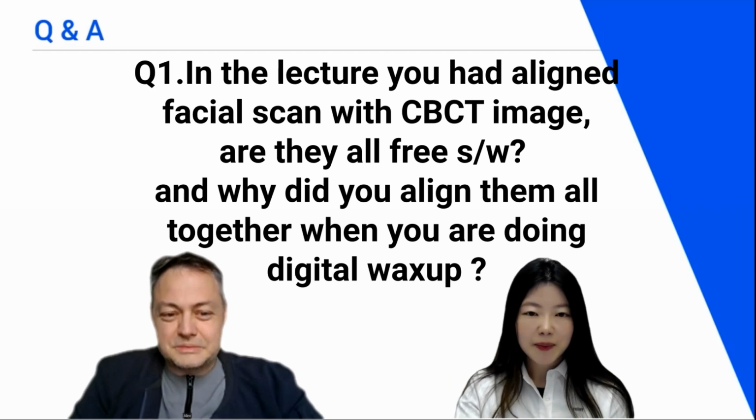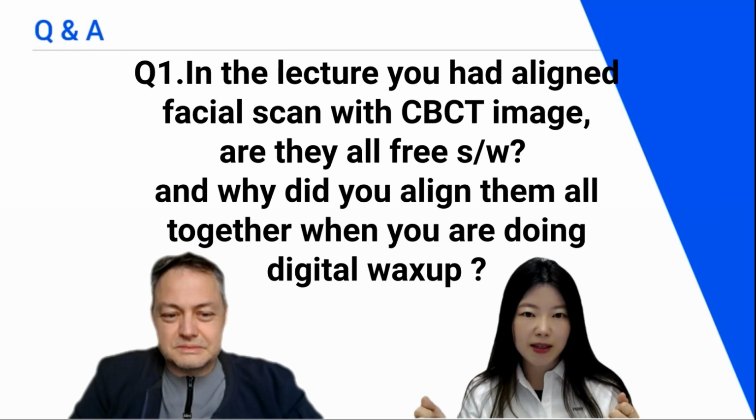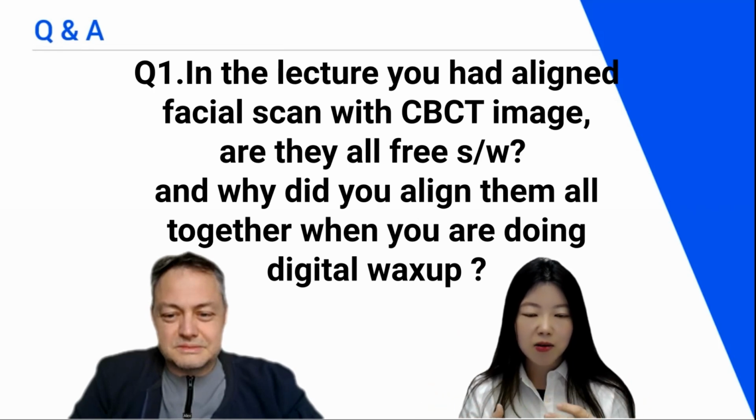Question number 1. In the lecture, you had just aligned facial scan with CBCT image. So are they all free software? And I also want to ask one more thing. Why did you align them all together when you're doing digital wax?